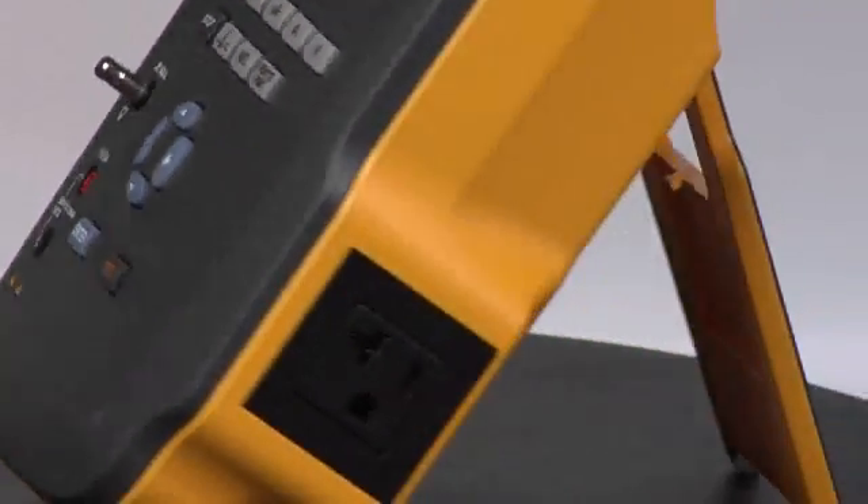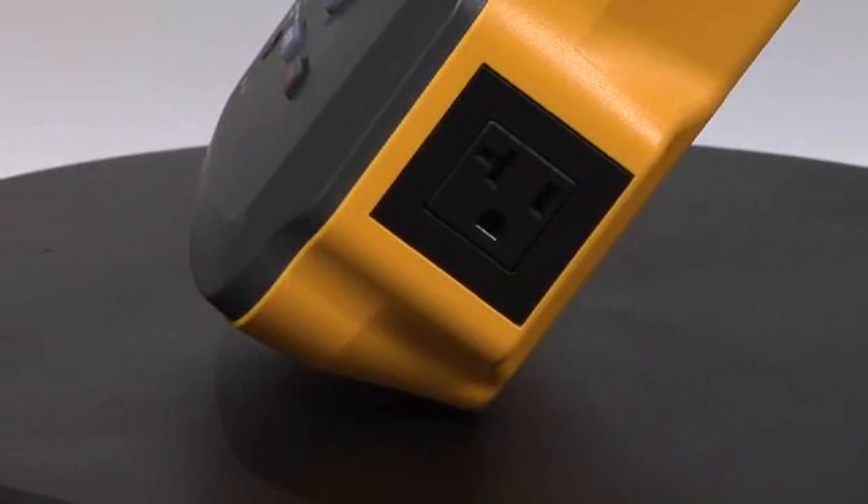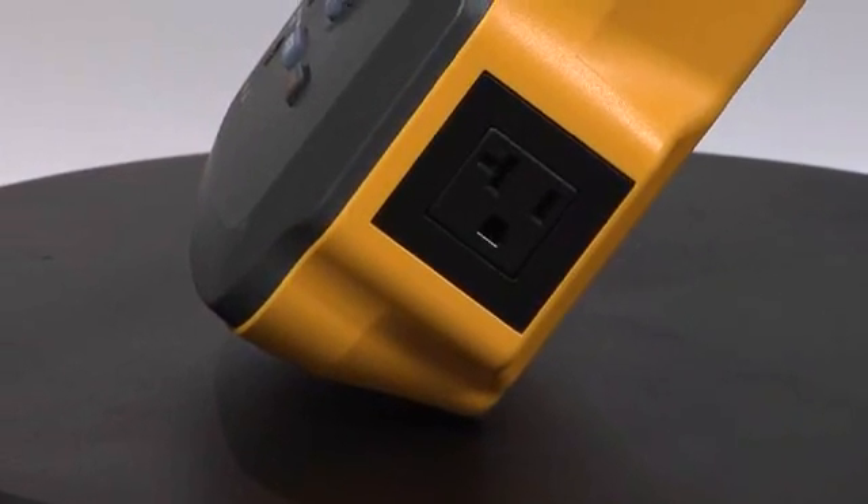Rotating around a little bit more, we see our equipment outlet for connecting the device under test. The outlet shown here is for the United States; there are other outlets available depending on your geographic location in the world.